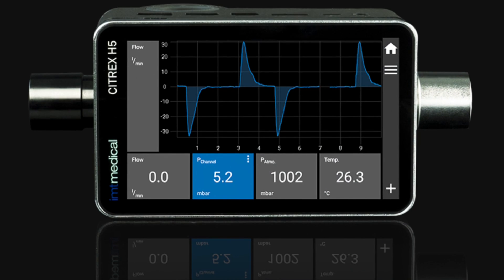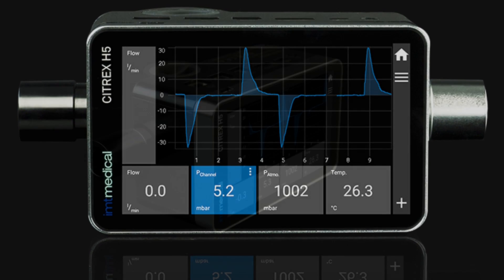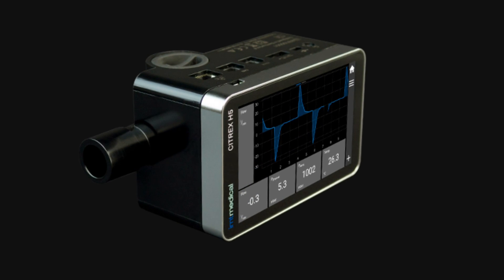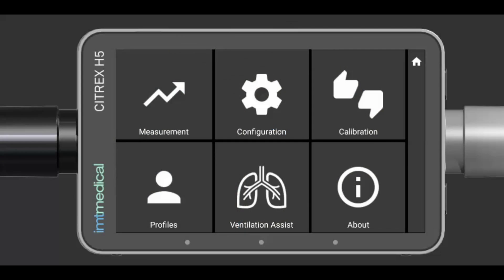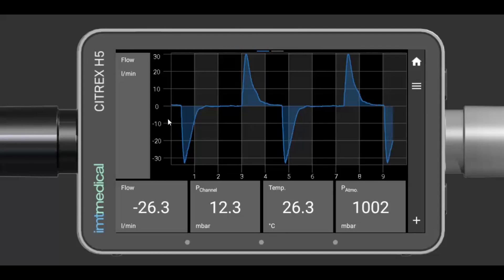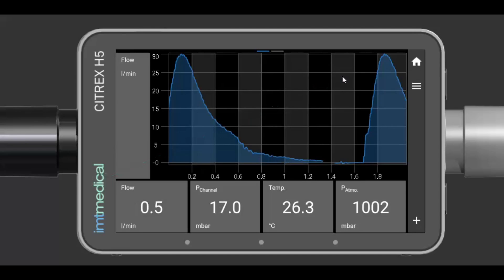Citrex H5, the best mobile gas analyzer in its class. The ideal all-in-one testing device for biomedical engineers, independent service organizations, anesthesia device and ventilator manufacturers. Citrex H5 is the gas flow and pressure measurement instrument with the most advanced user interface.